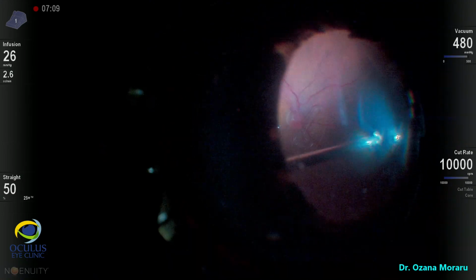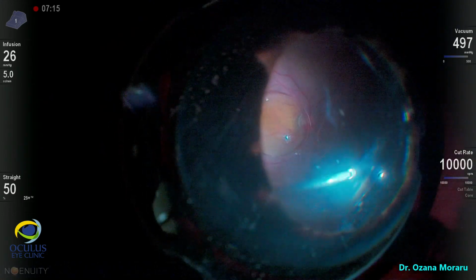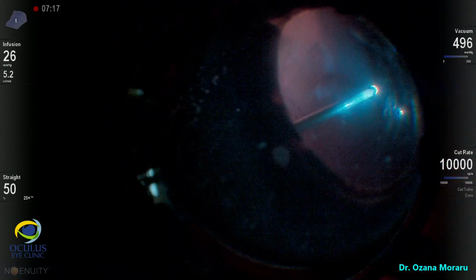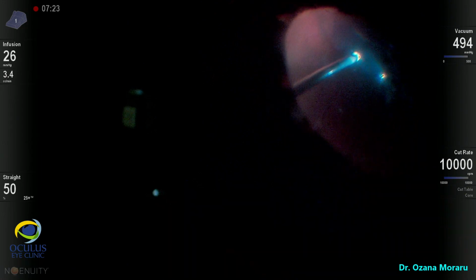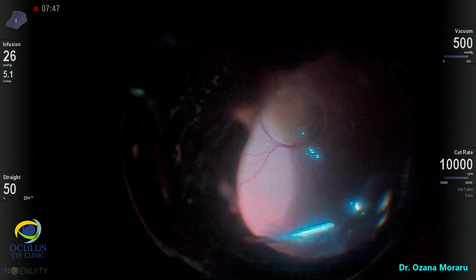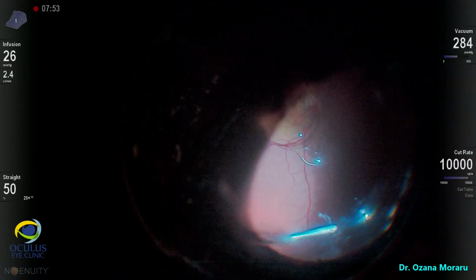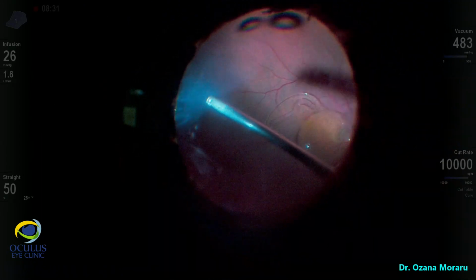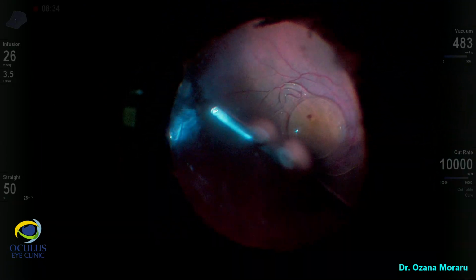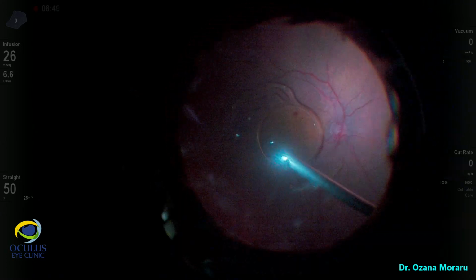We noticed the IOL had fallen exactly on the retina, on the macula, and we now perform the core vitrectomy and the peripheral vitrectomy without indentation, but we want to cut as much peripheral vitreous as possible. Our goal is either to remove the IOL completely or to use the same IOL to suture at the sclera.